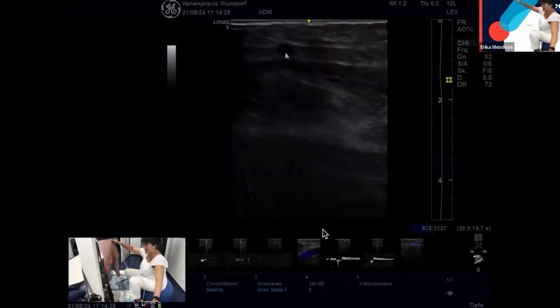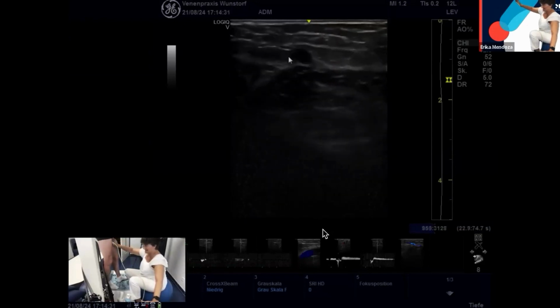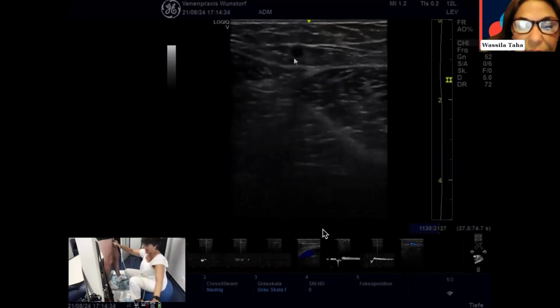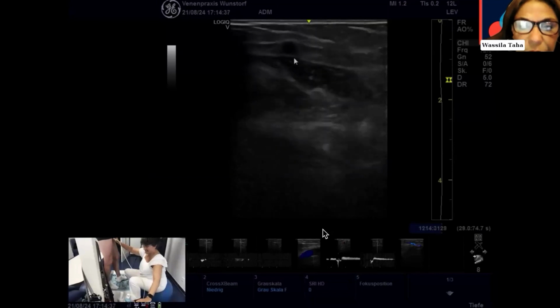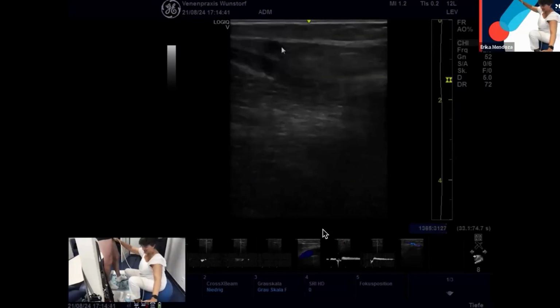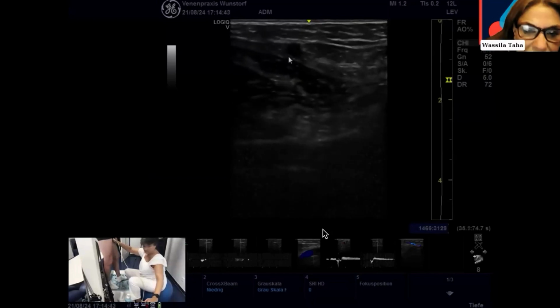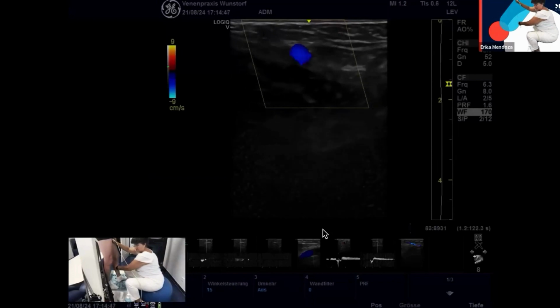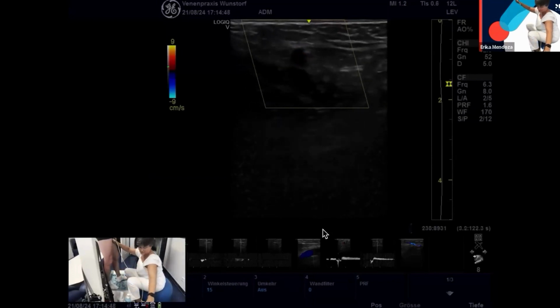All right. Sorry, I didn't know that. It would take some years for me. Very nice to see it. Thank you, Erika, because it's very important. And this one is a very healthy vein. You ask, why would I touch it on the thigh when there is no reflux?